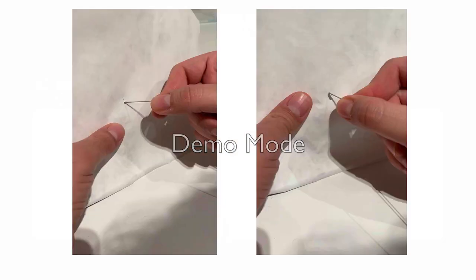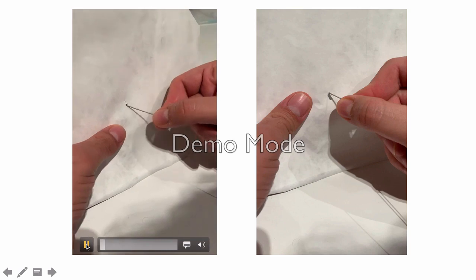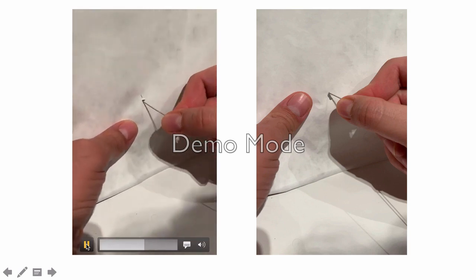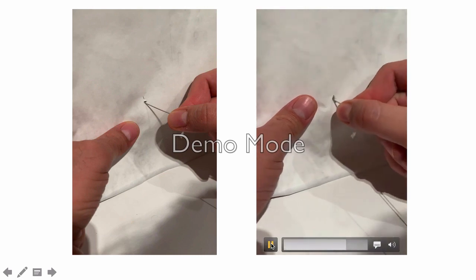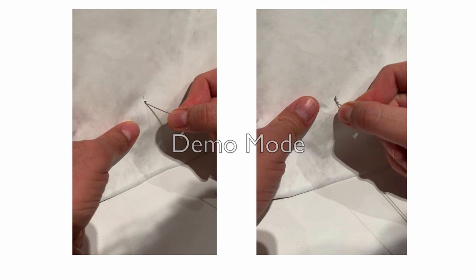How do you check for a skin bridge? At the left side, there is a quick video to see exactly how to check it. Do a circular movement around the insertion site. If there is a skin bridge, your guide wire will not reach the skin cut part. But if your skin cut is sufficient, then the whole guide wire will go down from the puncture site up to the skin cut.